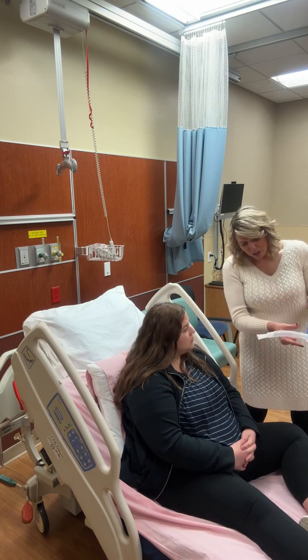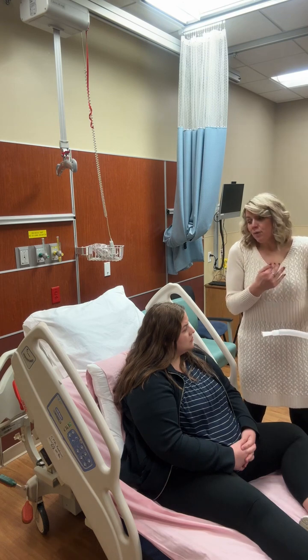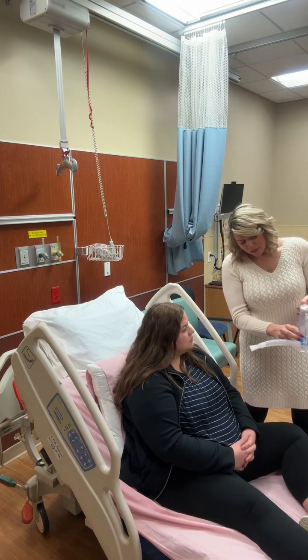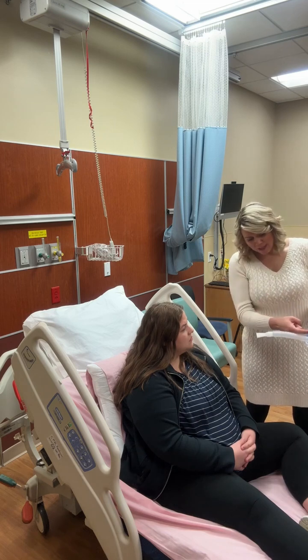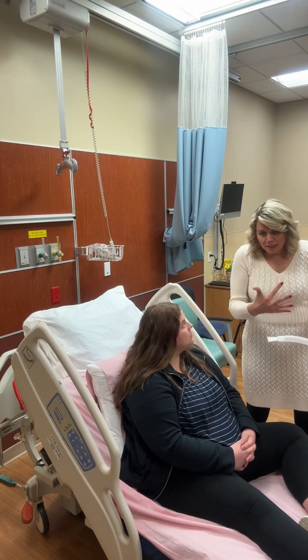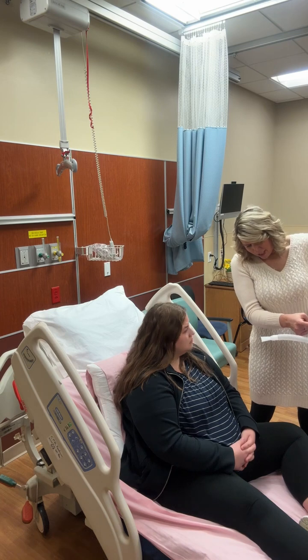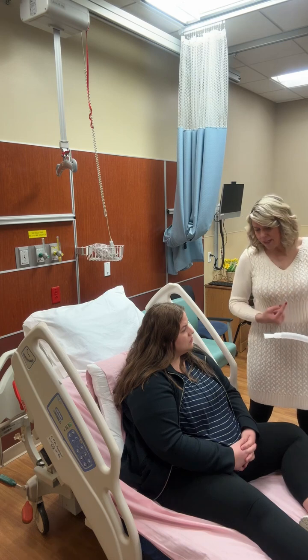And so what you're going to do is you're going to put this in your mouth, and you're going to hold this, and then you're going to take a nice slow deep breath in to expand the lungs. Okay? And when you do that, this little toggle here is going to move up. And if you breathe too fast and too hard, it's going to hit the top. It's going to make a noise, and that may or may not hurt. So for it to work and be therapeutic, we need you to control your breath hold, take a deep breath in that's slow, and this will kind of levitate right here. It says keep between the arrows, all right? When that happens, this is going to rise, and hopefully it hits 1250.